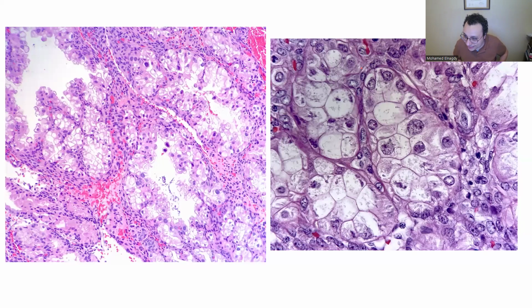Who's next? I think it's Heba, right? Heba is next, or you already went? Okay. What do you think about this? I see some hobnailing. You see some hobnailing, okay. And see the high power of the cells? Maybe foamy.